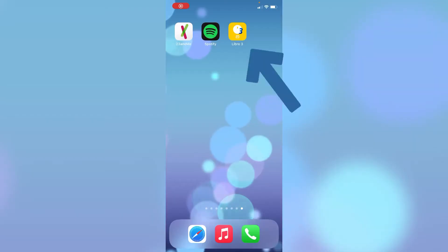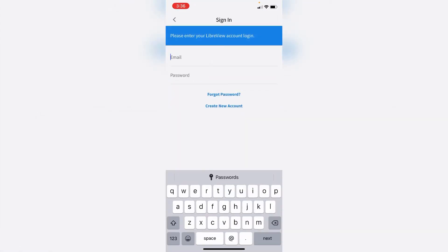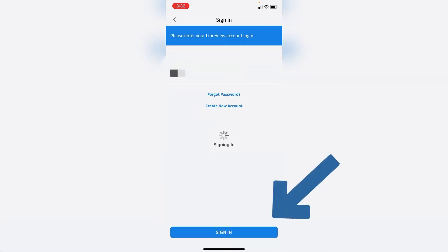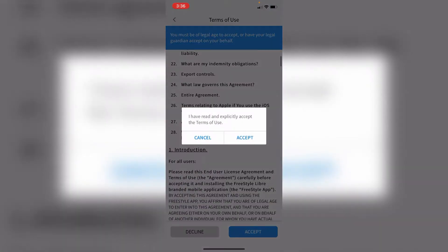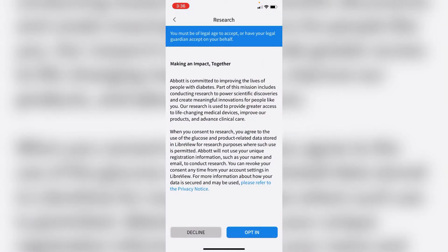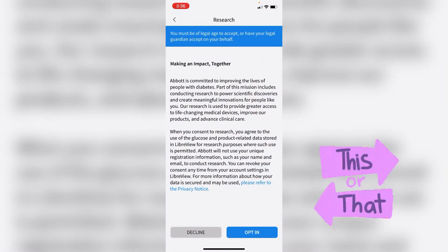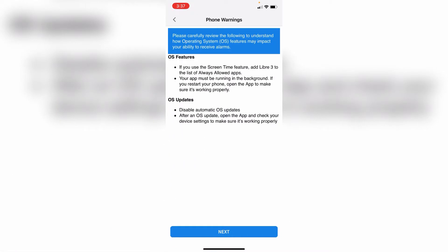Let's start with setting up the Freestyle Libre 3 app, because we actually can't even start the sensor before we have the app up and running. Download the app first if you don't have it, then simply open and click through the setup. I already have an account so I'll log in, but if you don't, create one. Remember to read through everything — if you accept, click accept; if not, decline. For example, they ask if you want to be part of their study — there's no obligation, just choose yes or no. Read through all of it at your own pace and click next.